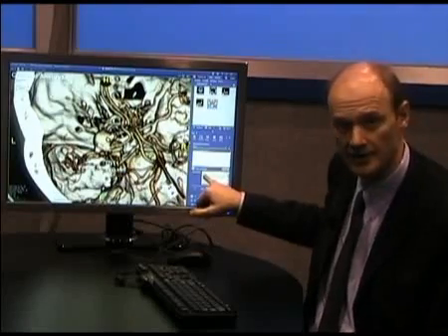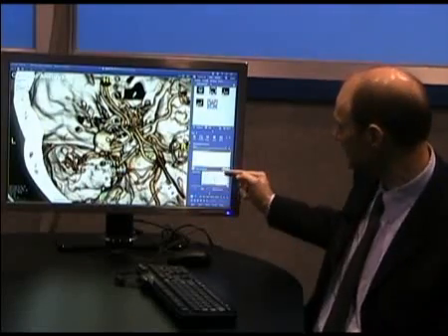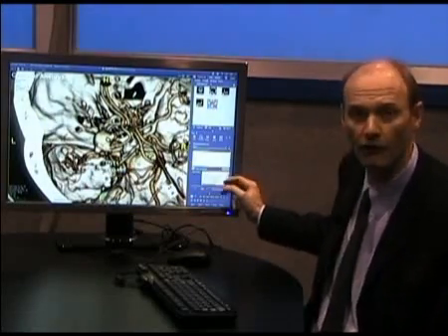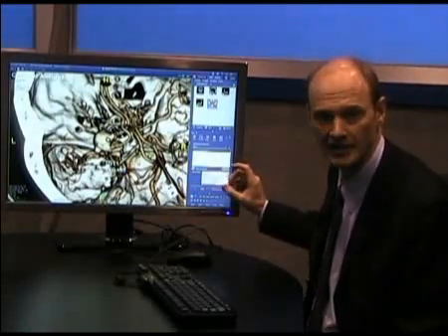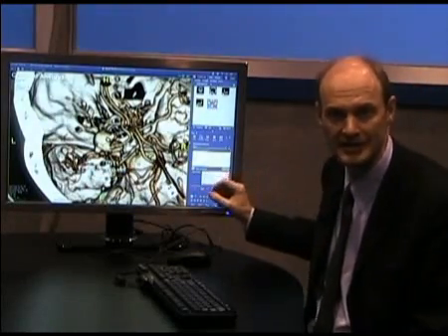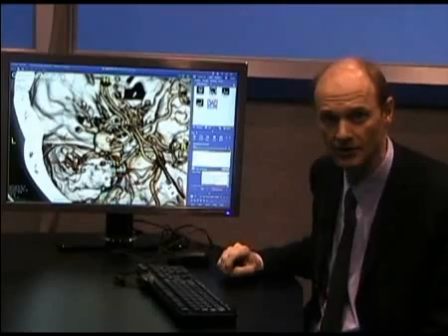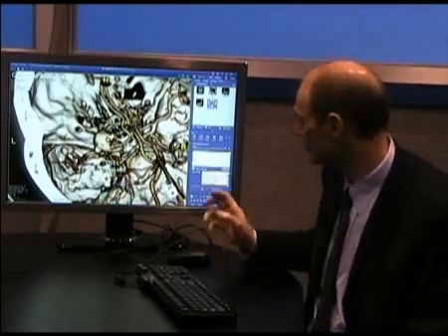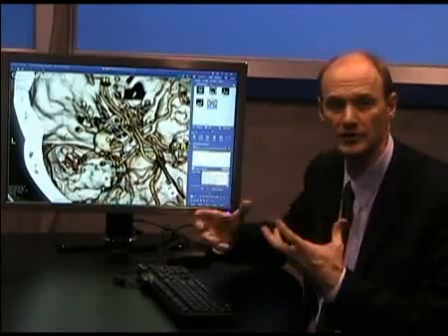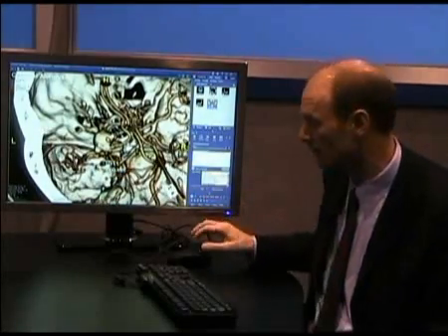As I start typing terms, the software is offering me the Radlex terminology — a standardized lexicon of terms — to ensure that I'm reporting in a standardized way.